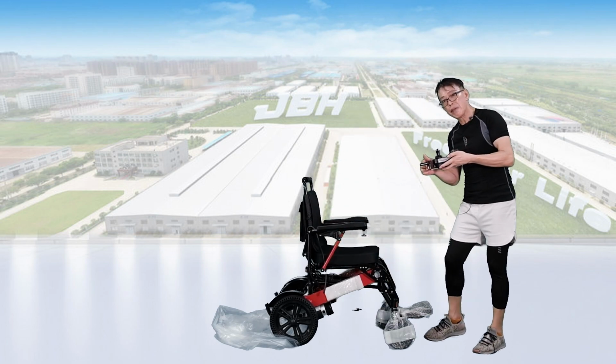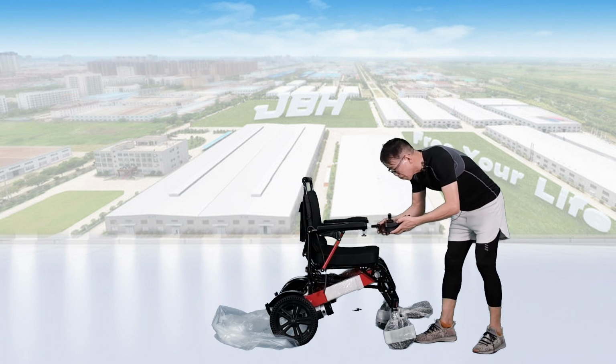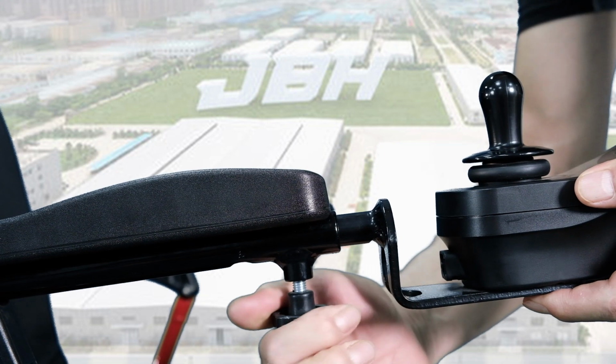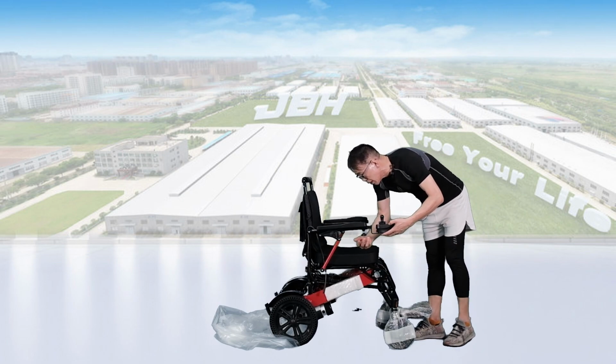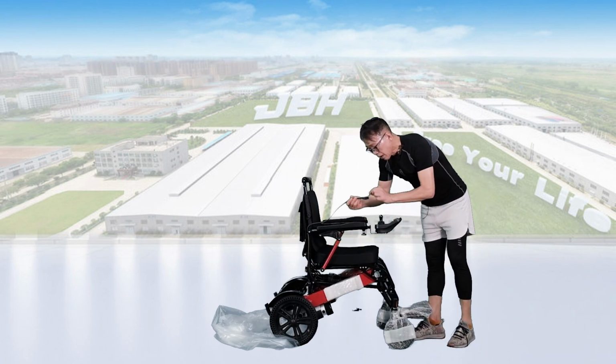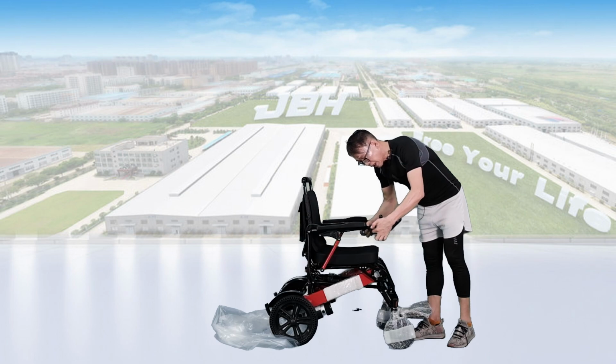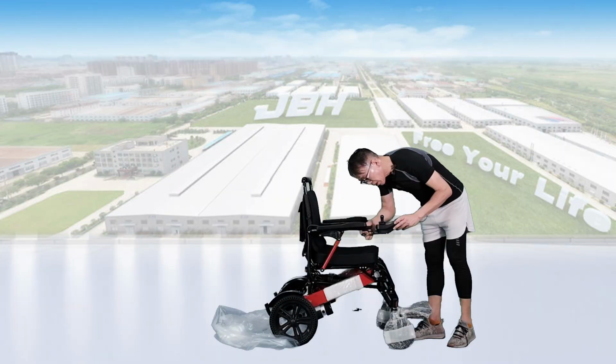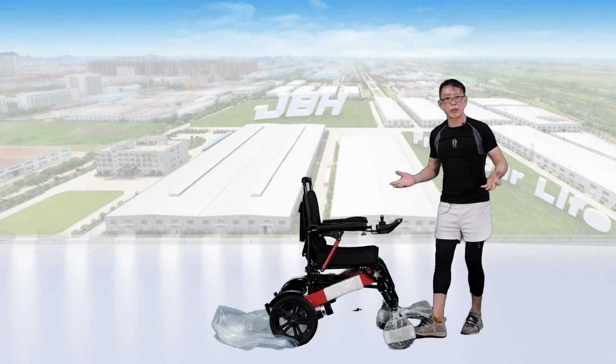Just insert the pipe of the joystick controller under the pipe of the armrest, and then we turn the knob to tighten. Connect the wire to the joystick on the back. We insert it here, and then until we hear a click sound, it's already set.